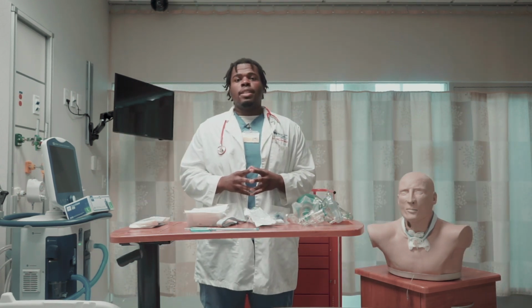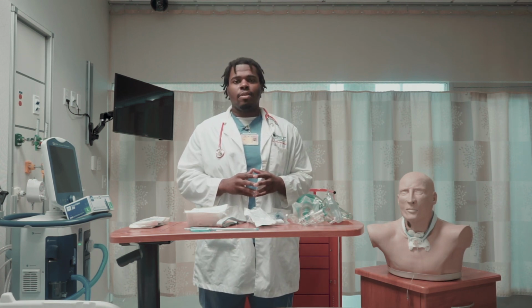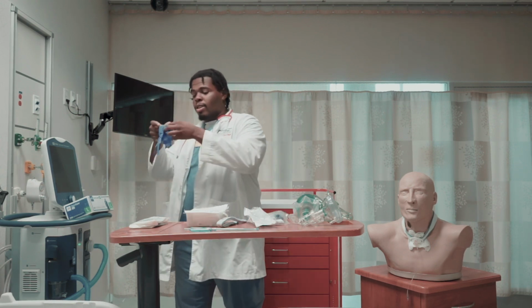After gathering all the necessary equipment needed for this procedure, you're going to wash your hands and don the appropriate PPE. Wash hands, don the appropriate PPE.